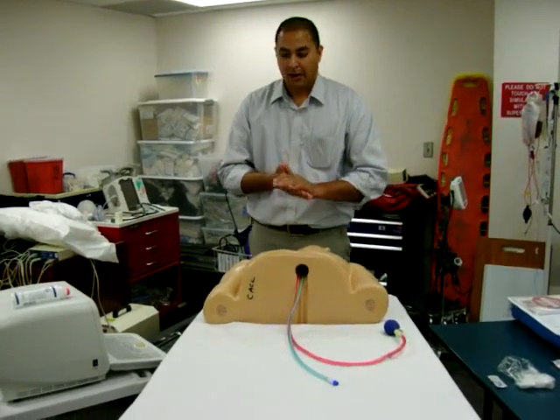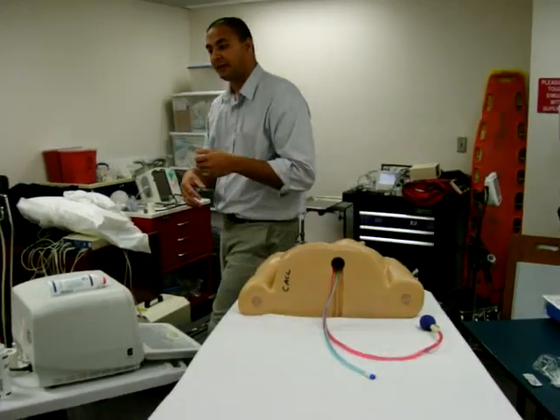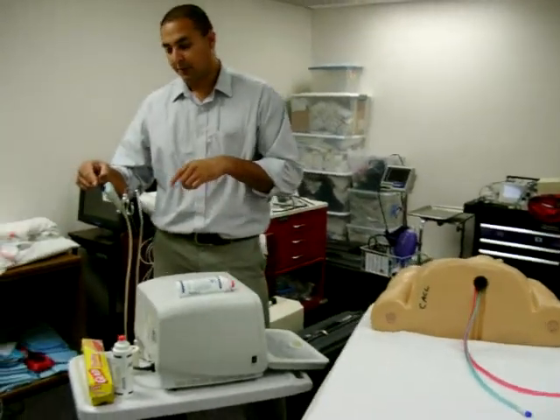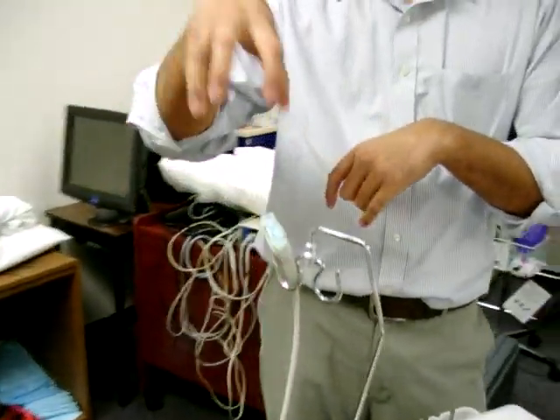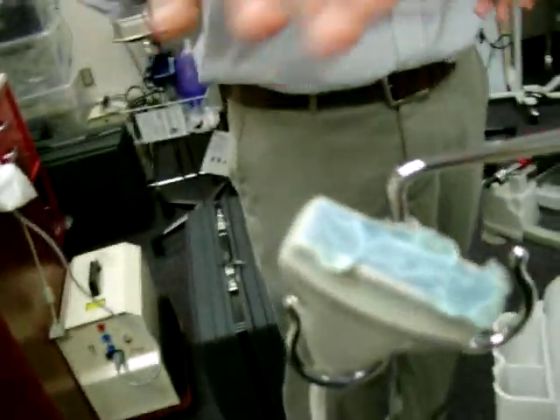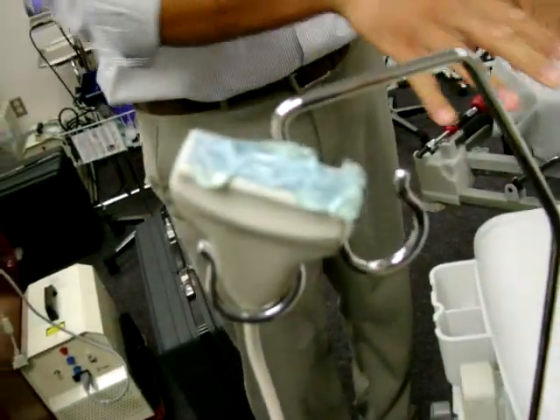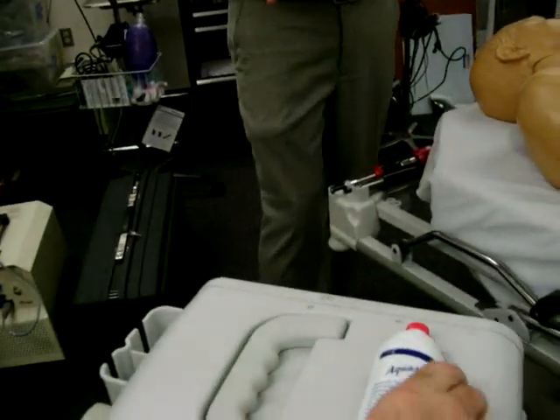We'll go through sterile technique and all the way through the insertion of the catheter. Now that we have everything set up, if you're using an ultrasound, it's sometimes helpful to place a little bit of lubricant. This does not need to be sterile because you're going to put a sterile dressing over the ultrasound probe, so the gel does not need to be sterile at this point. Make sure your ultrasound machine is turned on and positioned where you would like it.